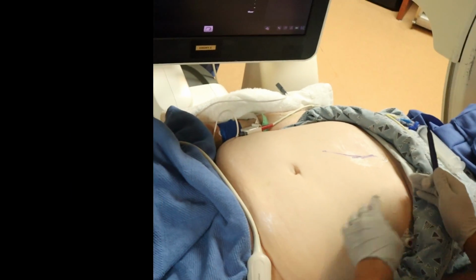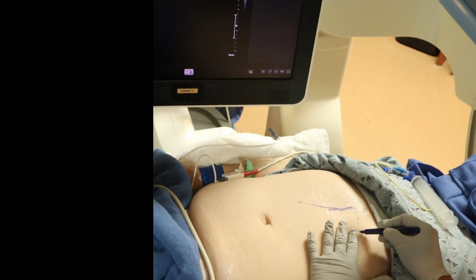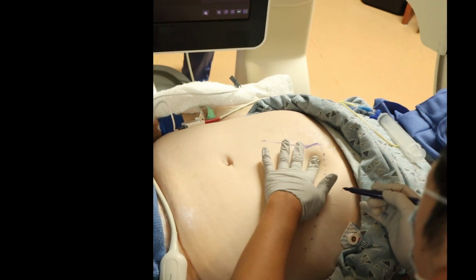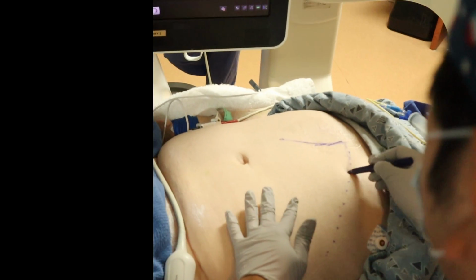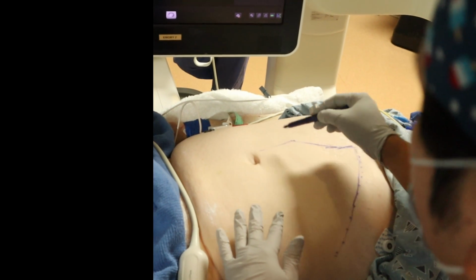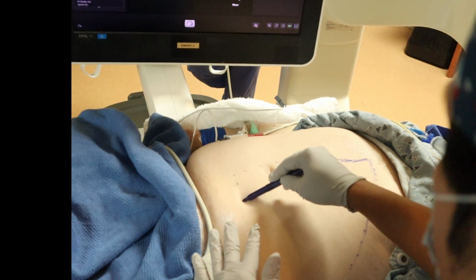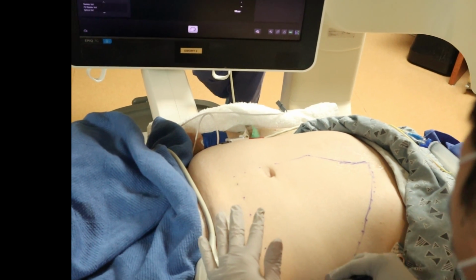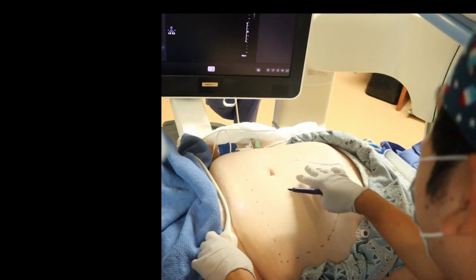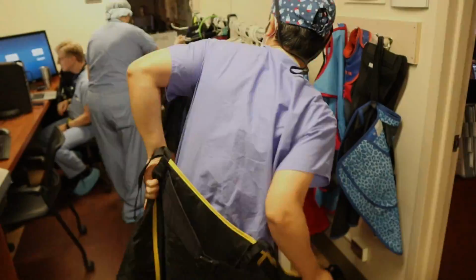And then we palpate her subcostal margin, so we don't want to go above the rib. That's going to be painful. So we create a space. We can probably just prep here like that. And that'll be more midline G2 for her, but this will be a good site. So we've looked with ultrasound. We'll start prepping.